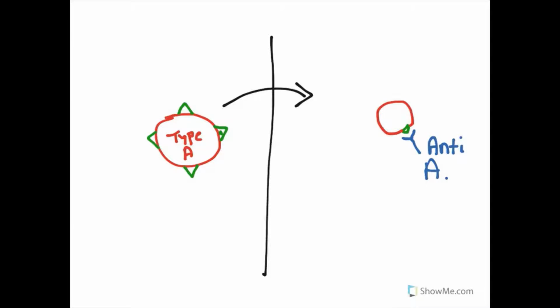These blood cells will have many of these antigens on them, and these antibodies will begin to attach. When they attach, they might attach another one together here. Another antigen here might bond to that one, and they might have some more here that bond.